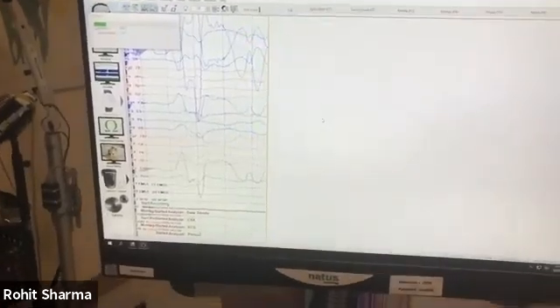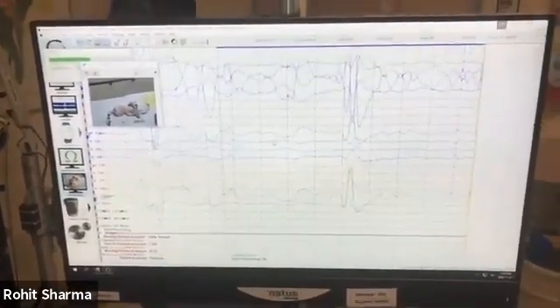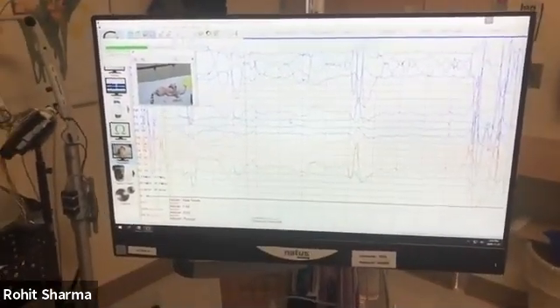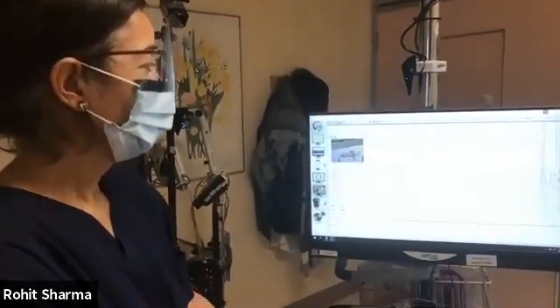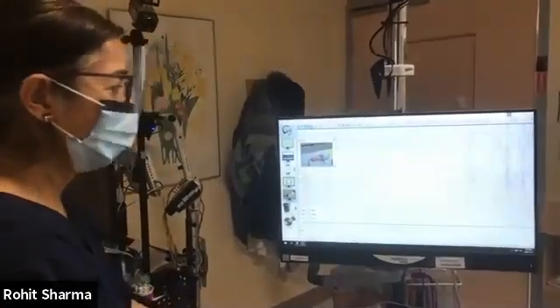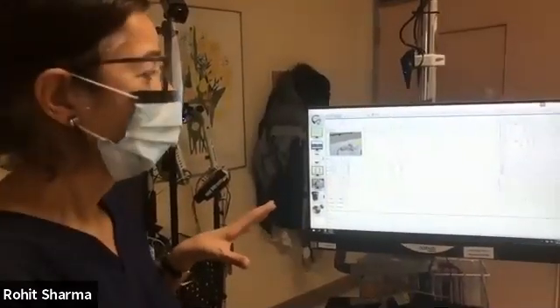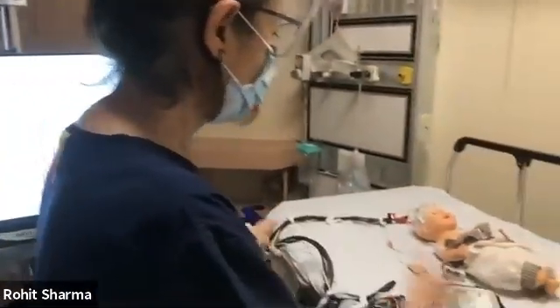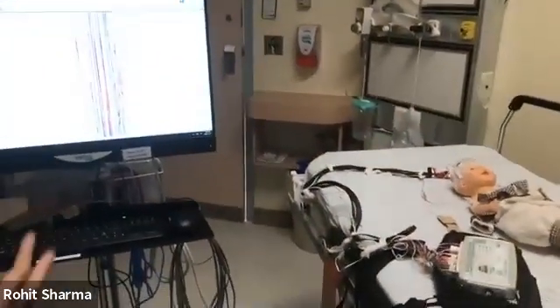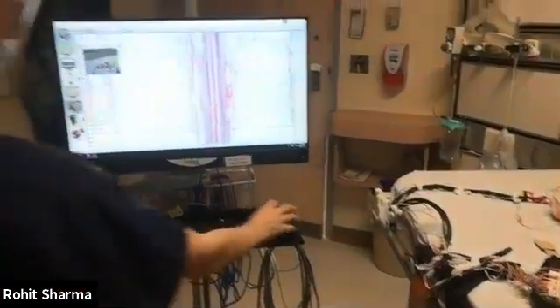So to give the example of an infusion pump or pacemaker as a possible source of interference. Sometimes what happens is we haven't had a lot of problems with pacemakers, but we have had problems with infusion pumps. Sometimes the drip of the infusion pump will cause an artifact on the EEG. So what we do in that case is make sure that our cables and our wires are not crossed with any of the infusion pumps or other pacemakers. You want to leave the EEG wire not running over anything or under anything. So we always leave it to the side of the patient so we don't have that interference.